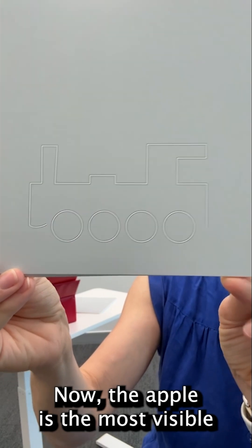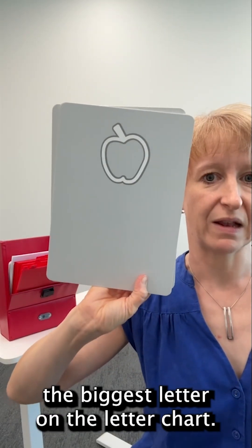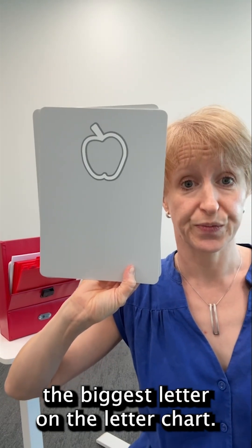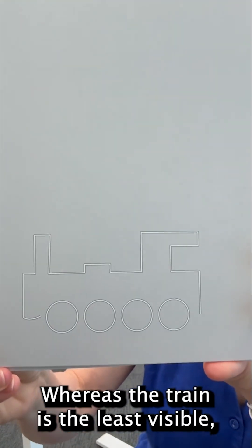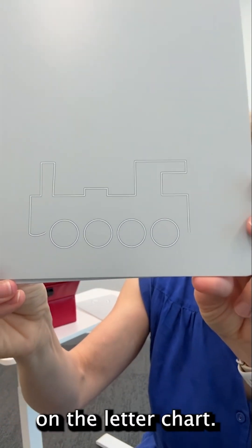Now the apple is the most visible symbol of the three that I've shown you — it's like the biggest letter on the letter chart. Whereas the train is the least visible, which is a bit like the smallest line on the letter chart.